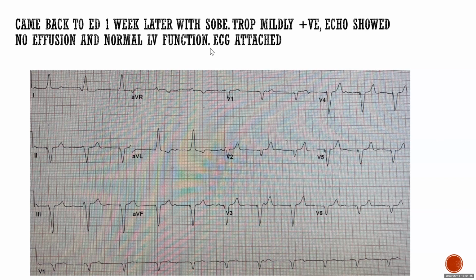Good. Okay, so this is the same patient we discussed. If I ask you, where is the problem? Which lead is the problem? And why? Atrial, yeah. Exactly. If you compare to the previous ECG, like the previous one, there's always spike, QRS, spike, QRS.